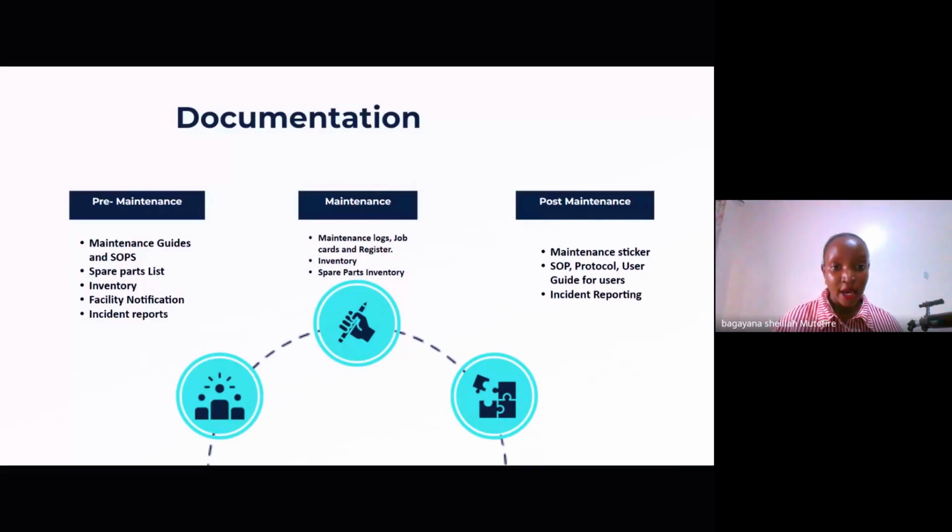So immediately they notify you or something happens, this is filled, and then we can decide the next course of action to take. For maintenance, we have maintenance logs, job cards, maintenance register, of course, the inventory, which is key for all biomedical workshops. You should have an inventory and keep changing it as you do work, revising the inventory. It should be a moving document. Spare parts inventory.